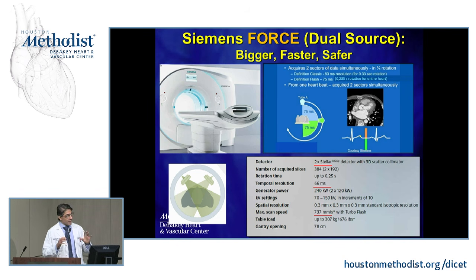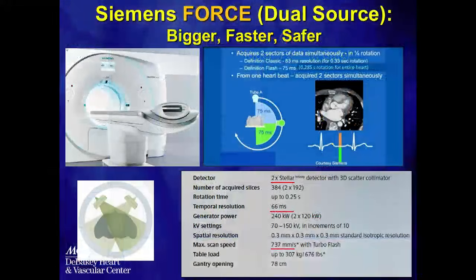So this scanner, compared to what you have seen, I've highlighted in red its salient features. Number one, it has 2 heads, which is its claim to fame.